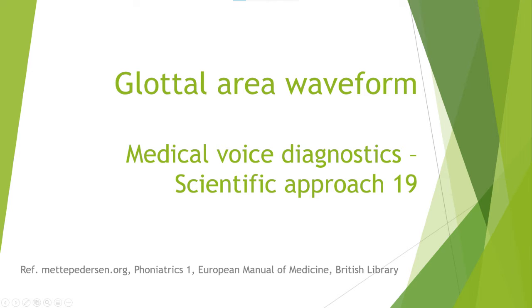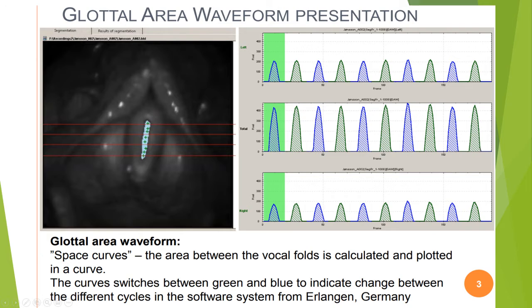Hello, and welcome to today's episode on glottal area waveform. An attempt has been made to analyze glottal area waveform quantitatively. Certainly, this is complicated with many individual variations. The glottal area waveform is calculated as presented.